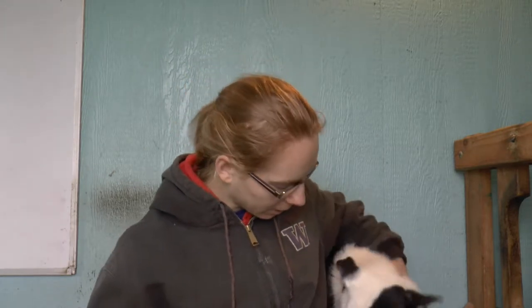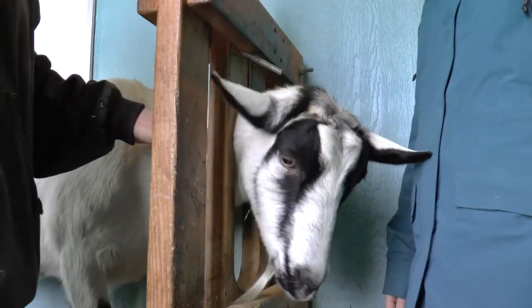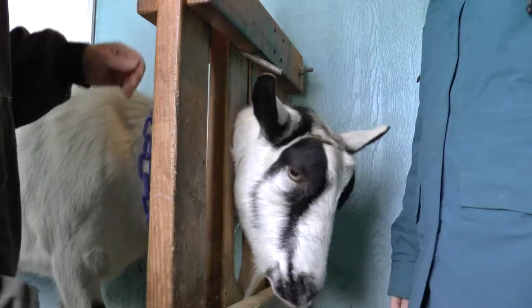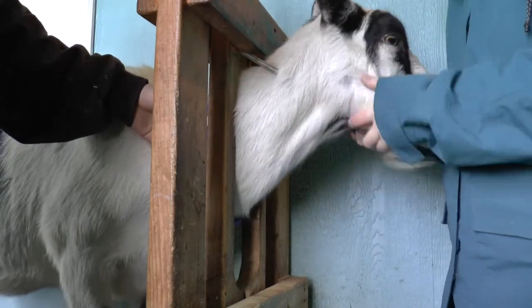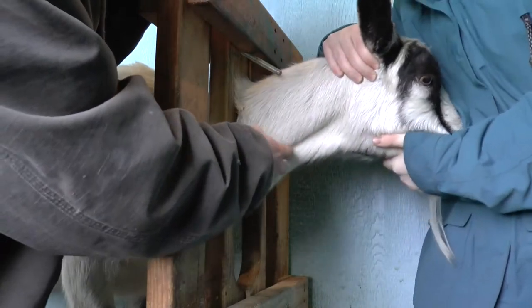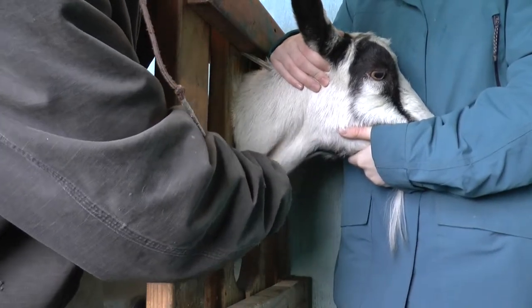The goats like to headbutt the wall and make all kinds of racket. The best way to do it is have a stanchion, or you can straddle them if your helper is tall enough to straddle them and hold up their head. Brittany's going to pull her head kind of through and then hold it for me. You don't want it too high or too much of an angle because it will mess up where the vein is. You can see right here in this big groove — the jugular vein is right in this groove, and they're on both sides so you can do it from either side.